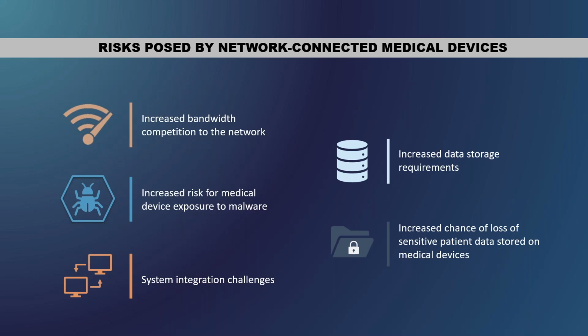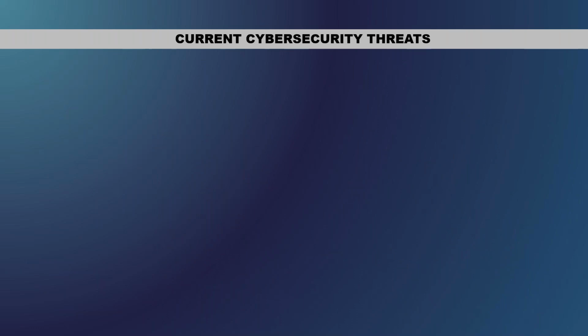And then there are increased data storage requirements and needing to adhere to hospital data retention policies. Some government agencies have a policy to keep data for over 70 years, so upholding that data, where it's all going, will need to be stored either on-prem or in the cloud. With those higher limits on data retention policies, it can also result in an increased chance of data loss, whether the patient data is stored on the medical device or the data is not transferred directly to be backed up onto a server, and just continues to reside on the device itself.